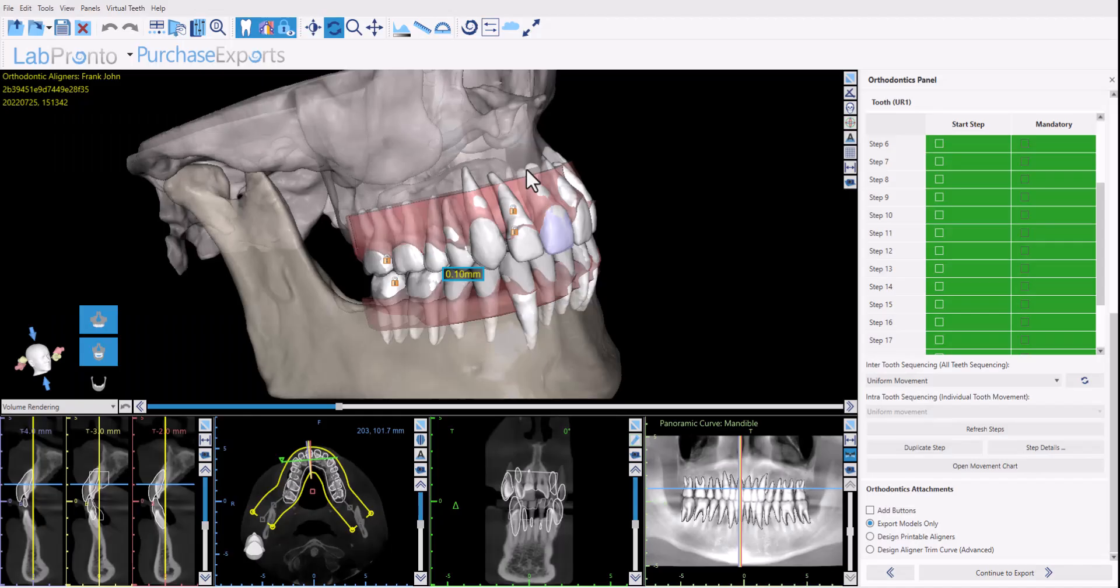Hello everyone, this is Michael from BlueSkyBio. In today's training tutorial I will be explaining the functionality to save the models for aligner manufacturing to your computer.